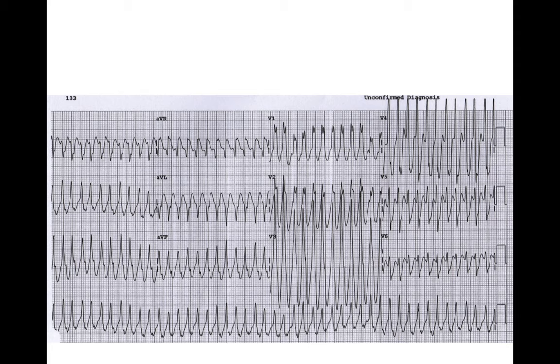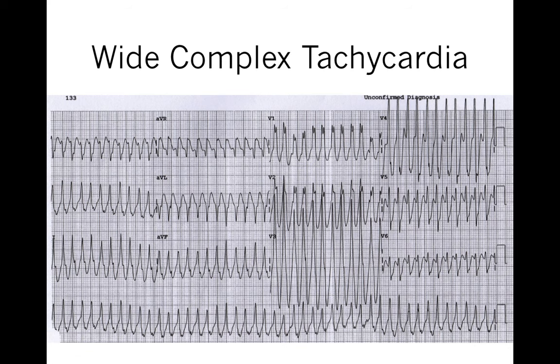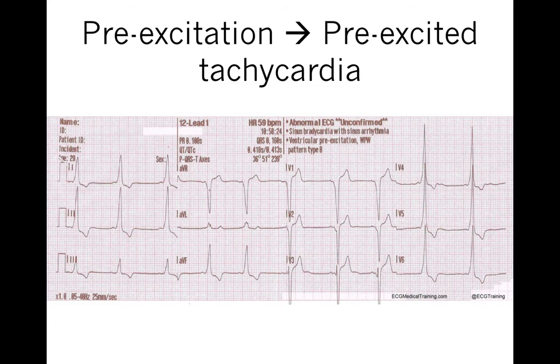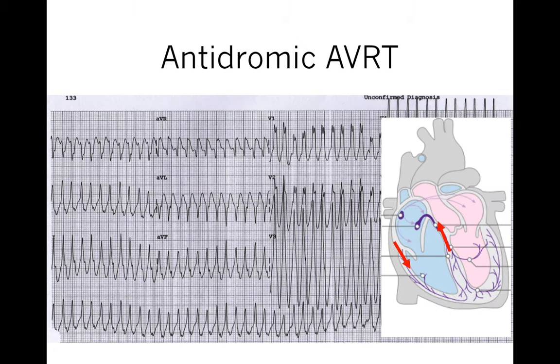Here's another example of a wide complex tachycardia. Looking at the rules discussed, this looks like ventricular tachycardia — it does not look like a typical left or right bundle. However, after getting the patient out of their rhythm, we see that they have pre-excitation: they have a delta wave. So that was an example of antidromic AVRT where the patient has an accessory pathway and depolarization is going down the pathway and up the AV node. Because depolarization goes down the pathway through muscle rather than the His-Purkinje system, we get a wide complex QRS and wide complex tachycardia.